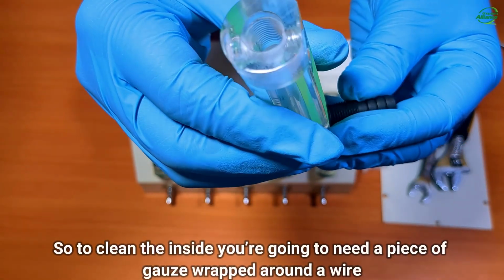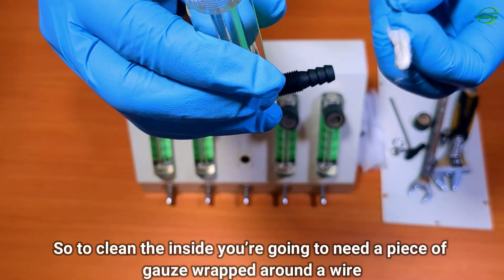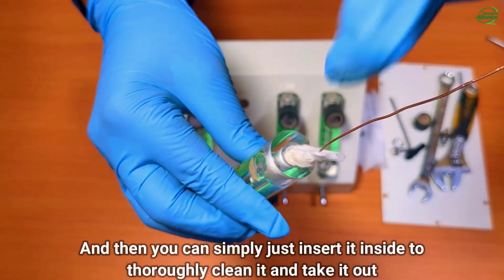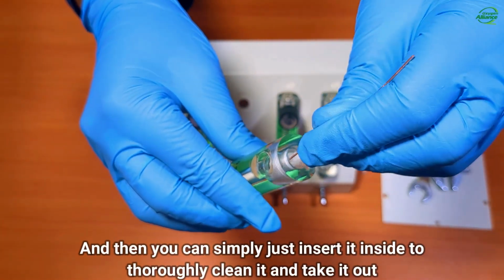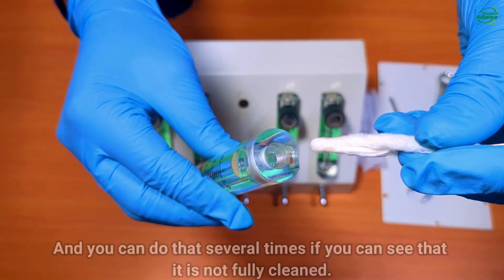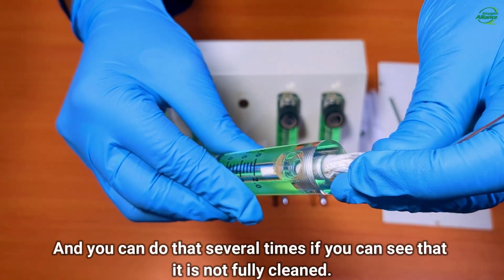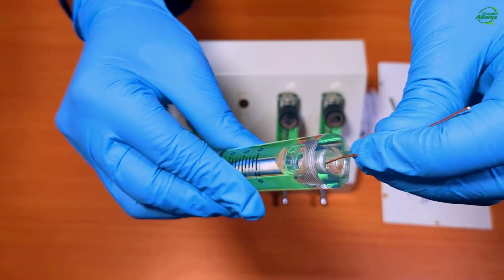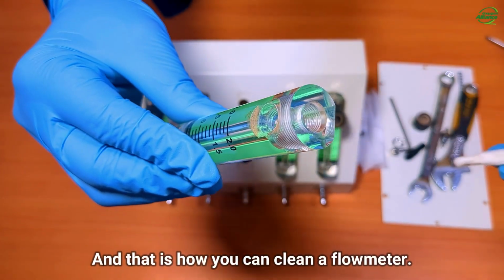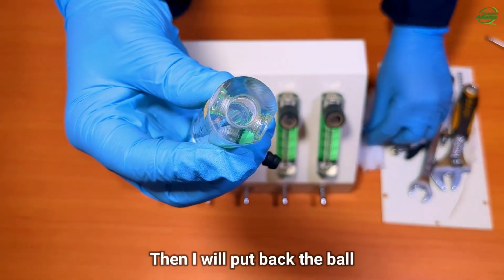So to clean the inside, we're going to need a piece of gauze wrapped around a wire. And then you can simply insert it inside to thoroughly clean it and take it out. And you can do that several times if you can see that it is not fully cleaned. Then I will put back the ball.